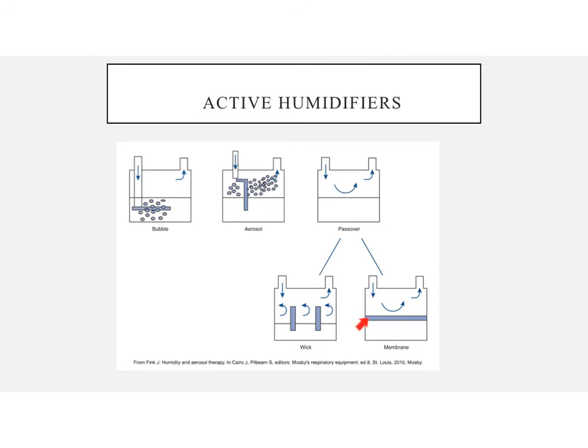And then the membrane, so here's the membrane, the blue. So our water's on this side and our gas is on this side. The water cannot cross the membrane, only water vapor, and then it goes out to the patient.